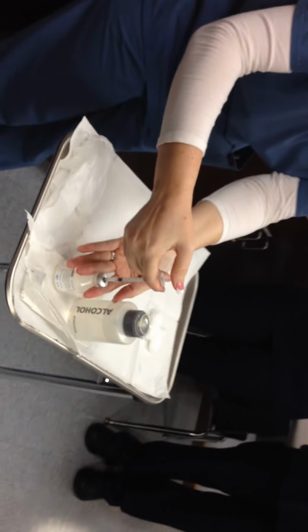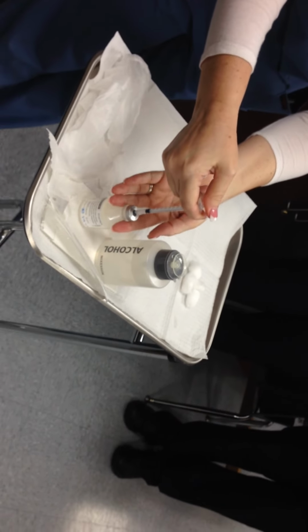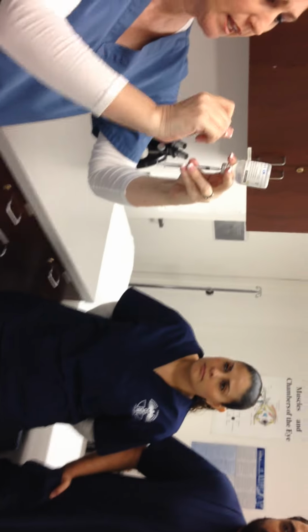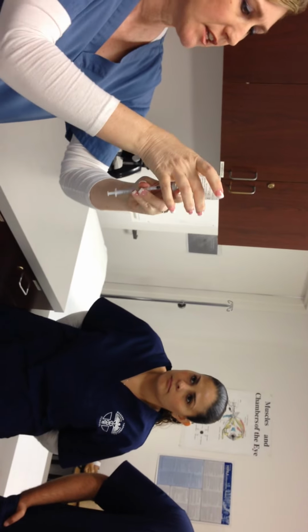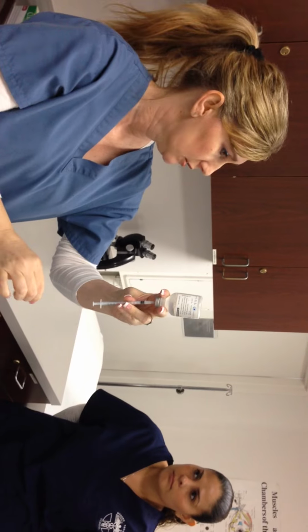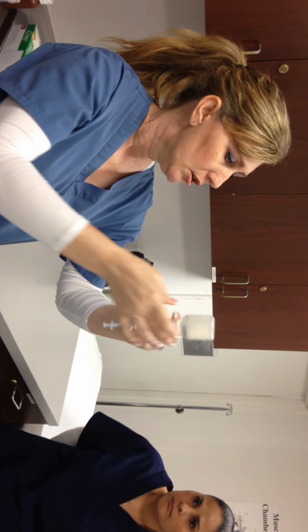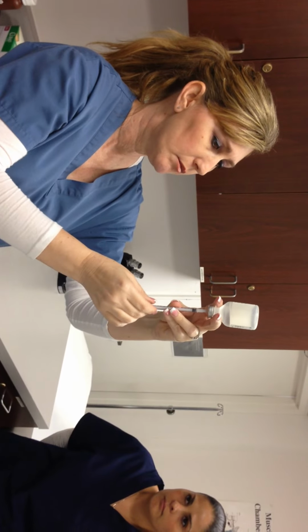Now, we put this right in the center. Push it in. Air to air. So first, you're going to push in the plunger. Air to air. Okay? If we don't push the air in there, what happens is this is eventually going to collapse on itself, and every time you put a needle in there, it's going to start pushing it out 100% fast. So we don't want that. We want to create that negative pressure.